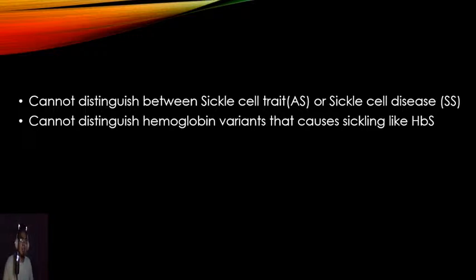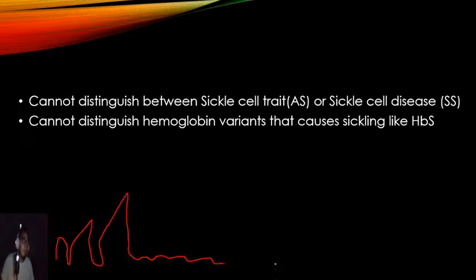What happens there? You're going to see reports like these: hemoglobin A, hemoglobin A2, hemoglobin A1C, and then hemoglobin S peaks are here. This is usually for normal patients. For patients with hemoglobin S, we'll have hemoglobin A.